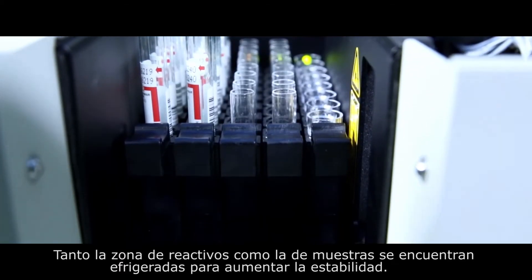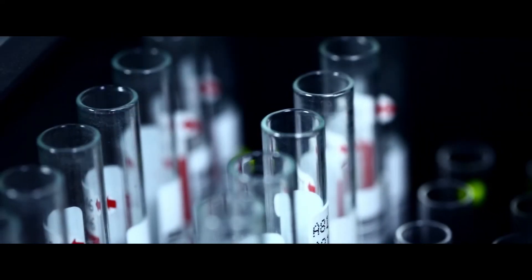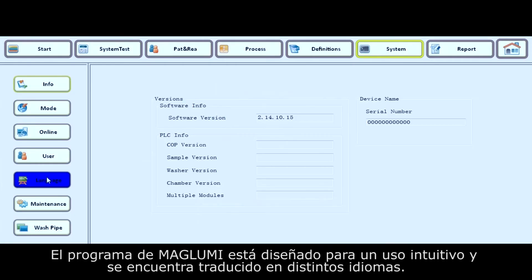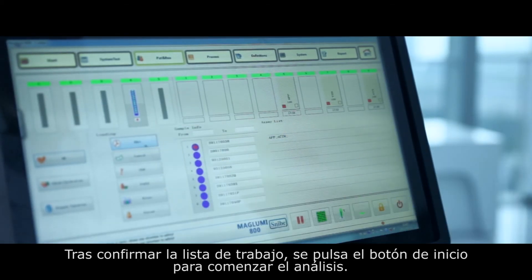The reagent and sample areas are also refrigerated, which helps increase stability. Maglumi software can automatically obtain the work list via a laboratory information system (LIS) or via manual input by the operator. A multi-language, user-friendly interface also facilitates operation.